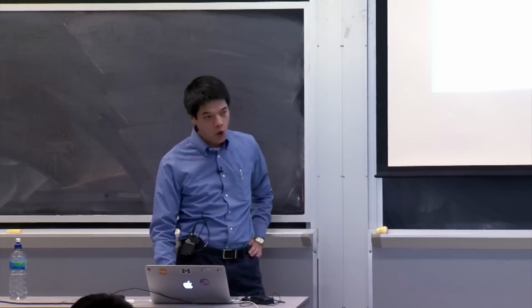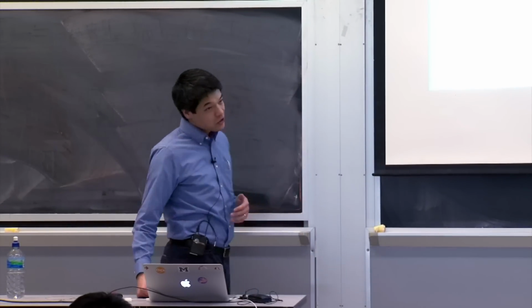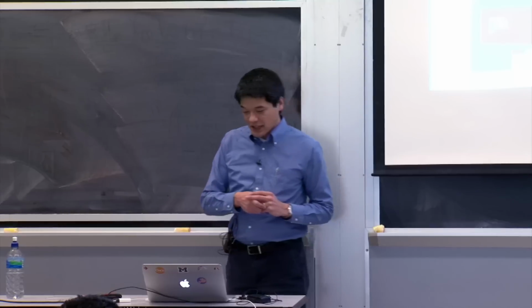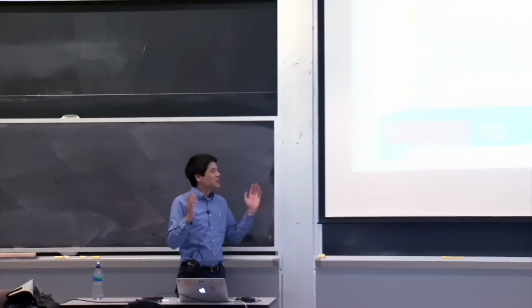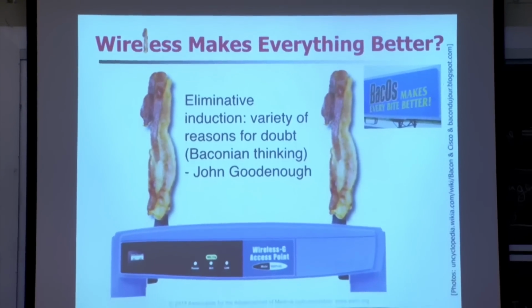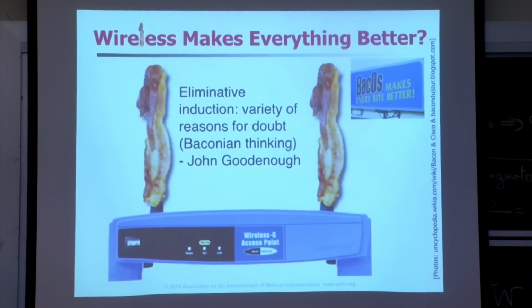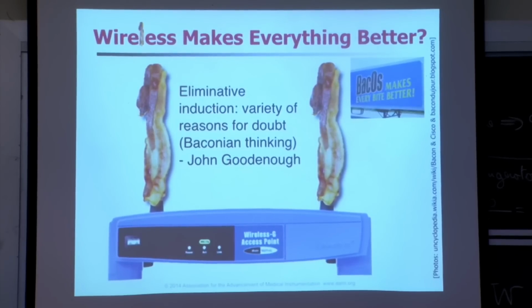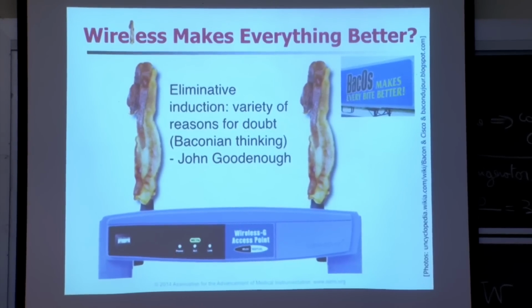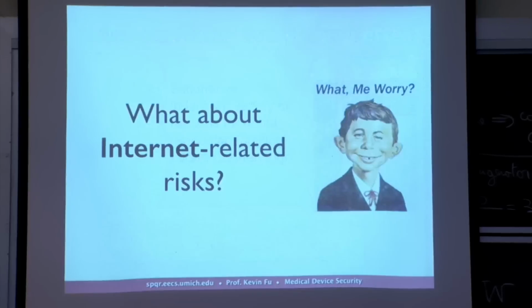Of course, if you go to the other extreme and just say, I want to put wireless everywhere, you'll get different kinds of risks. I've dubbed this the bacon theory of wireless. My mother's from the Midwest, so she used to say that bacon makes everything better. And I've noticed there are some device manufacturers who seem to be putting wireless everywhere without necessarily thinking through all the risks. It does have its benefits, but you need to think very strategically before you add this to a safety critical device: what are the security risks that are going to be opening up?